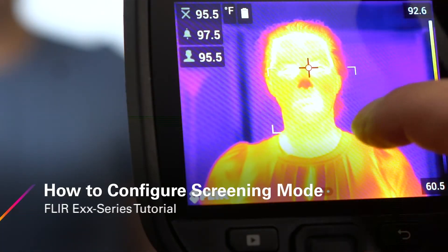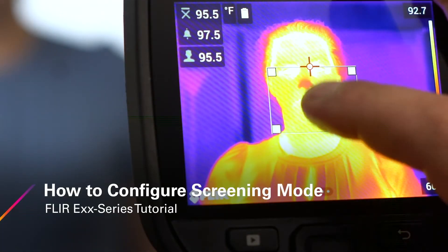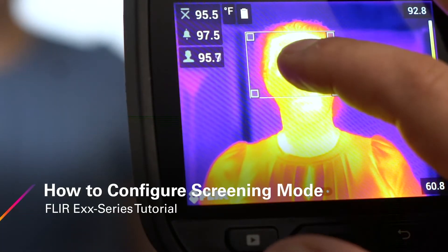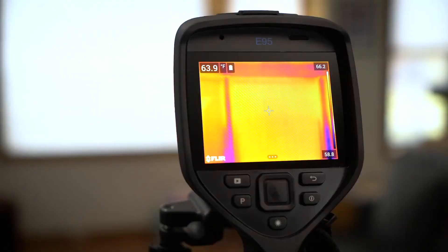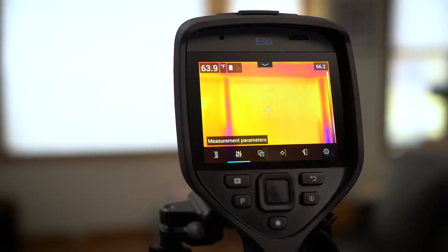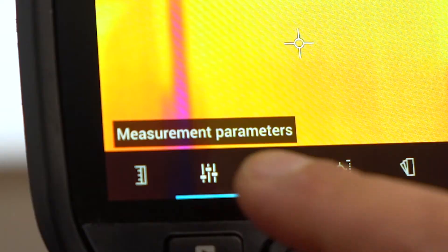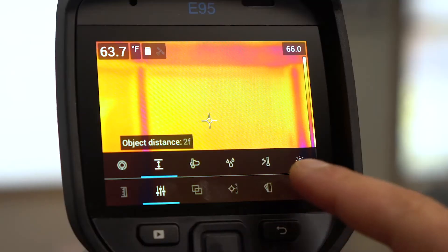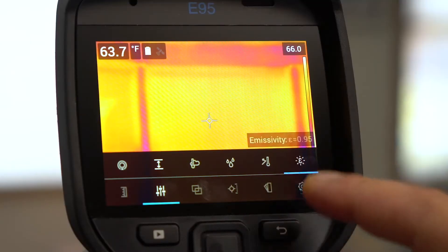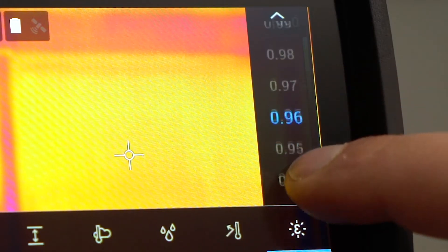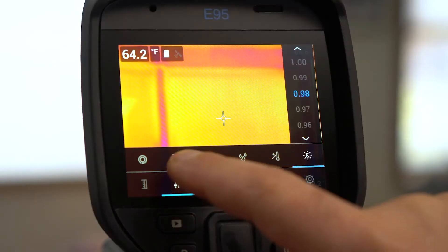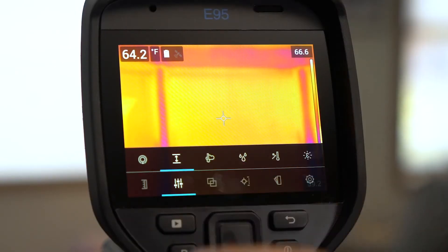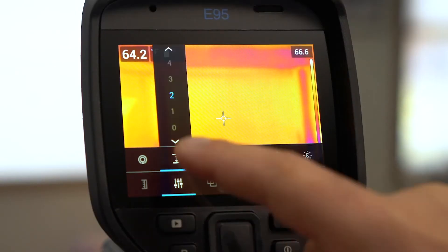This video demonstrates how to switch from the factory default settings to the screening mode. First, tap the screen to bring up the menu and select measurement parameters. Set your emissivity to 0.98. Next, set the distance from your camera to your target.